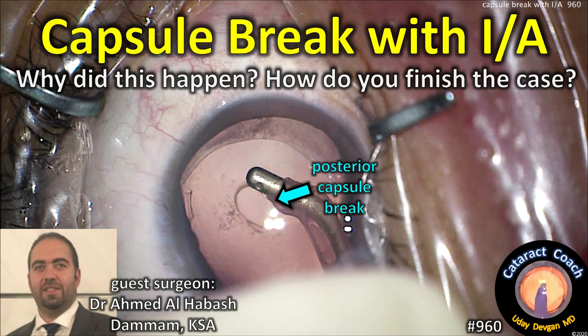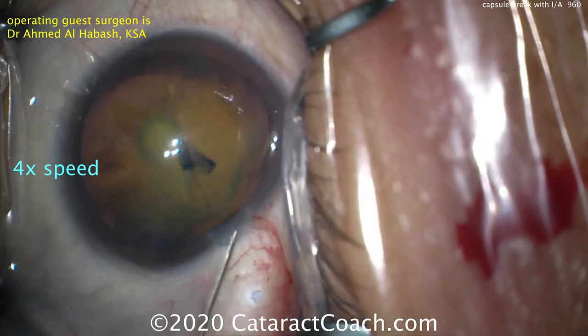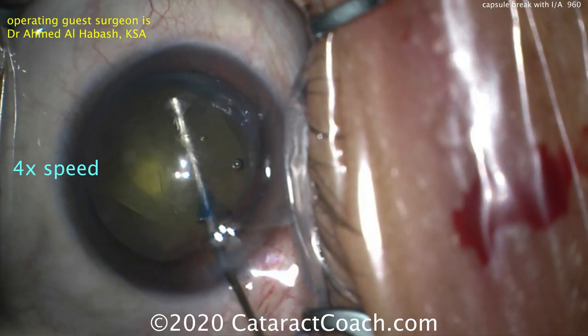CataractCoach.com: capsule break with IA — why did this happen and how do you finish the case? Our guest surgeon is Dr. Ahmed Al-Habash from the Kingdom of Saudi Arabia. Here's the cataract — look at it, that's a posterior polar, so we know there's going to be a challenge here.